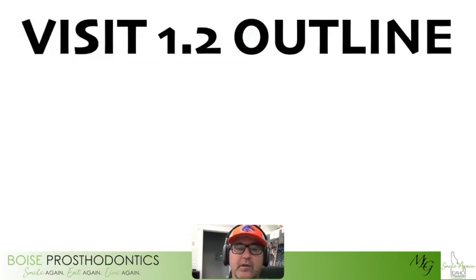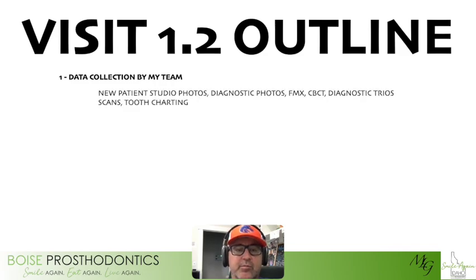I'm going to outline what that exam looks like, or that data gathering process. And so there's a portion that my team will gather, like my assistants and team members. And so in that process, they'll do the new patient studio photos, diagnostic photos, full mouth x-rays, a CBCT if needed. They'll get diagnostic intraoral scans. In our office, it's a Trios, and they'll do most of the tooth charting.